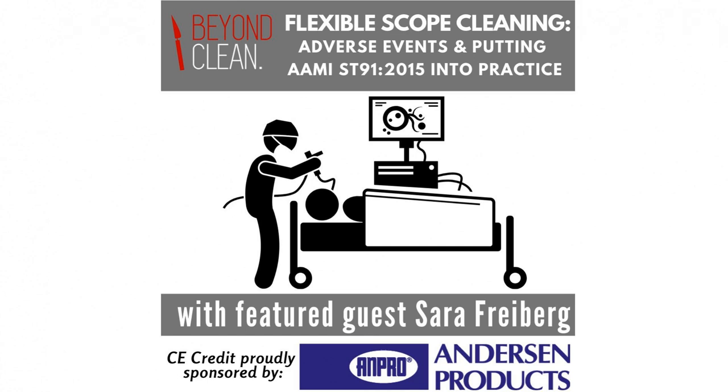And I know that several companies are starting to come into the market with flexible borescopes that are designed to, you know, I describe them as a scope for a scope. And they're designed to enable technicians to actually inspect these channels. Are you seeing those scopes being very widely adopted or not? And if so, you know, what are some of the risks that go along with that?